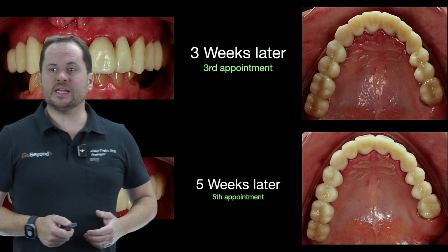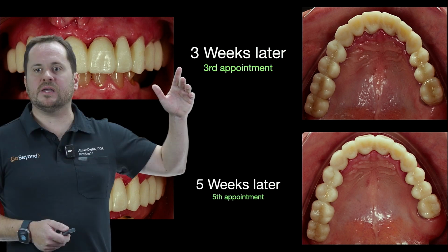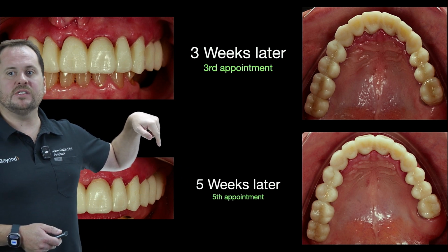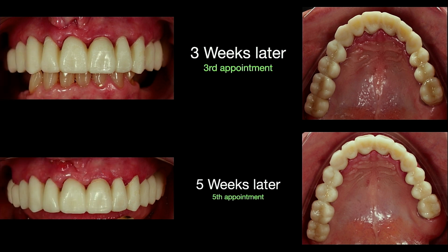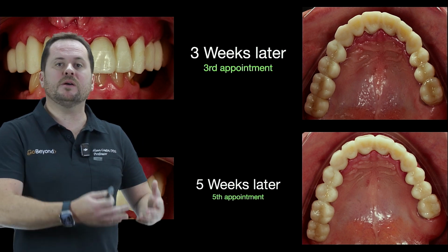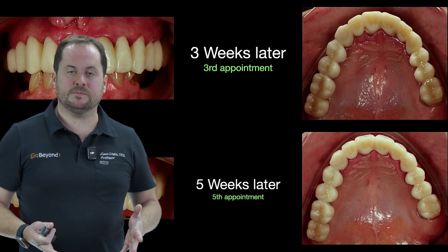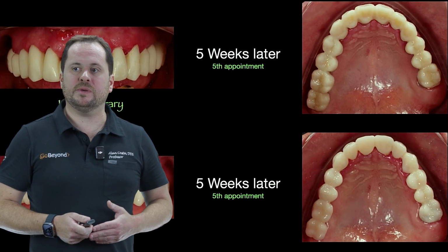And in this comparison, where we have 3 weeks later and then 5 weeks later, we can see clearly observable changes in this specific time frame. So see how the tissue has already been improving, and in this situation here, we already have a much better response. Because it's no use, folks, to rush through the provisionalization process for the patient in this scenario, in any case. You have to give a bit of time for your tissue to respond calmly. And all of this is done with printed resin in a highly efficient manner with a very acceptable aesthetic for the patient.